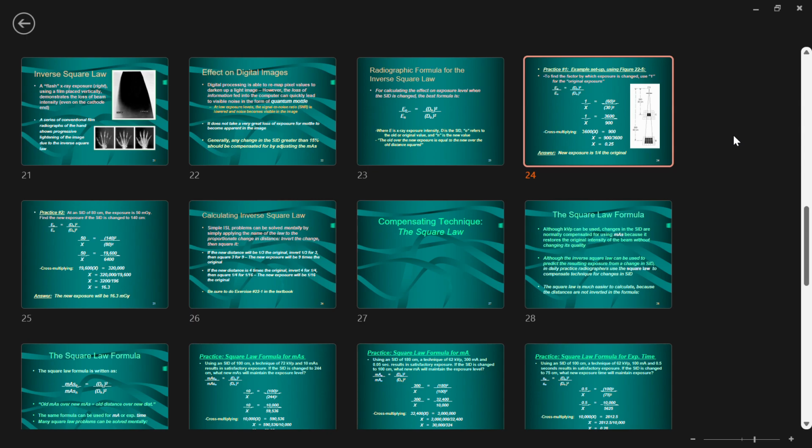Okay, so typical lumbar spine distance would be about 40 inches. Now we can just use a different unit, we can go to inches now, okay? And a typical lumbar spine exposure, something around 150 milligray-ish. Then we'll go to a new distance. Let's say we didn't change anything, everything remained the same, but now we're gonna go to a distance of 72 inches, which is the other standard SID. So this would be correct, 40-inch distance and that much exposure. So now let's plug that in and let's see what happens.